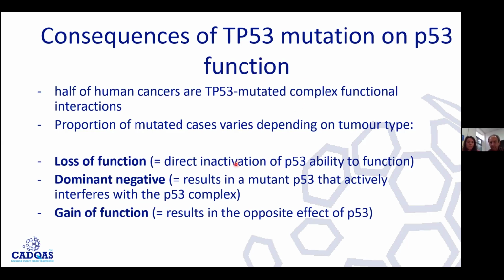However, the function of P53 would be very important if we were to develop, for instance, therapies, because a certain IHC pattern is not equivalent to a particular P53 function or change in function. So that means we're using this just to recognize the pattern and understand what diagnosis we can make, how we should comment on the case, how we should classify it, but only in relation to other alterations.